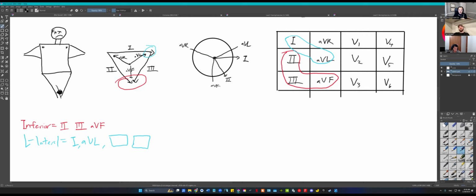You don't change the angle, you just slide them along. In your mind's eye, if you take this horizontal left pointing arrow and move it over here, that's lead 1. Take lead 2, transplant it over here. You're just sliding these arrows along. If you make all of your tails start from center, this is what it looks like.